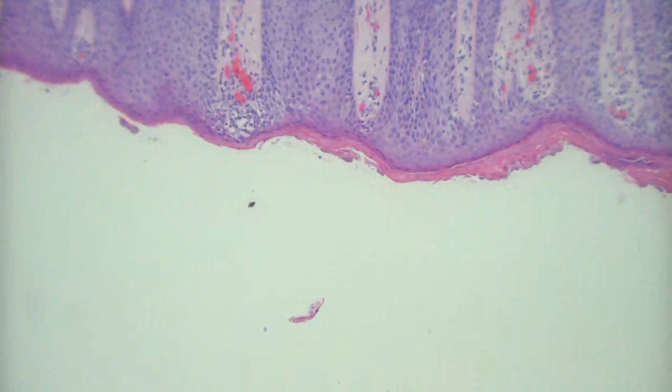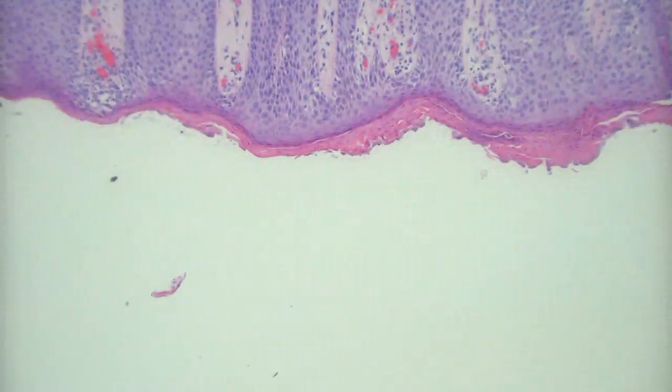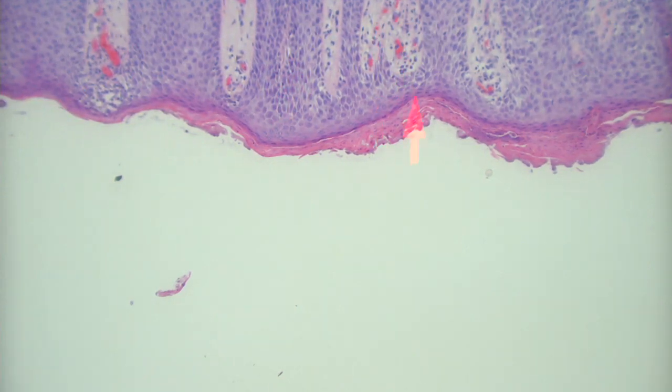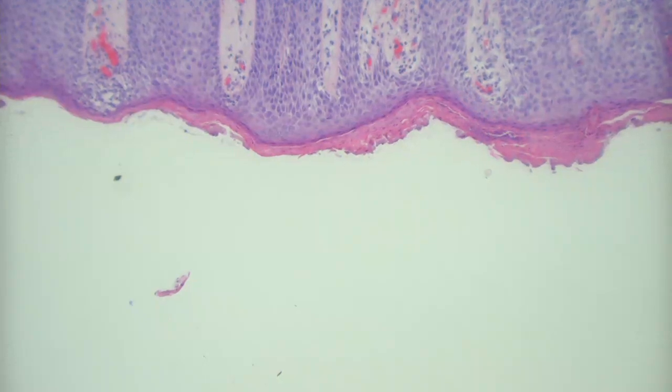So what are you thinking about here? It looks very psoriasiform. Yes. Got the increased superficial dermal vasculature. Thin suprapapillary plates. So what's the diagnosis? Psoriasis. Yeah. But is there anything unusual about this?